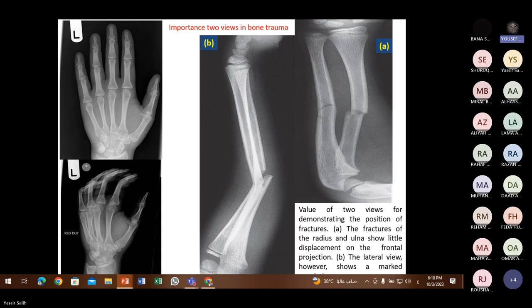No abnormality. Yes, what do you see? Is it calcification? This one? White? No, this is a sesamoid bone. This is sesamoid. Do you mean another part, or this one? No, this one. Yes, this one. This is a calcification of the tendons, as a sesamoid bone, which is considered normal.